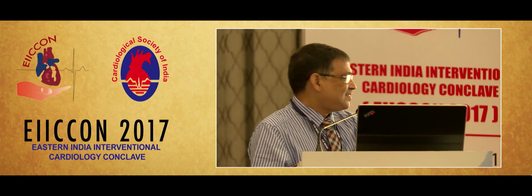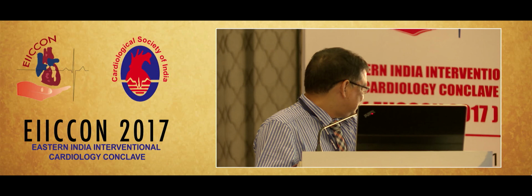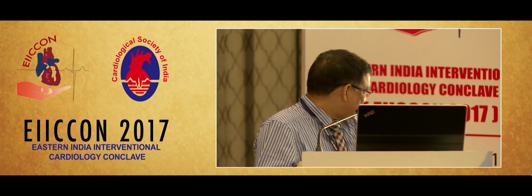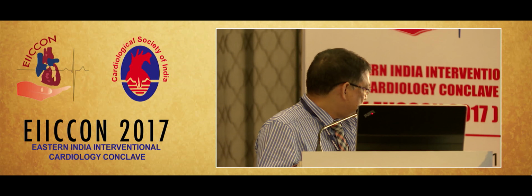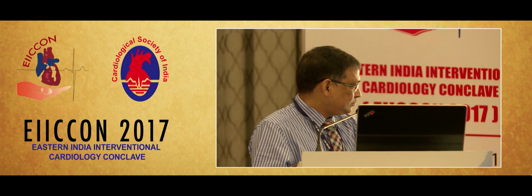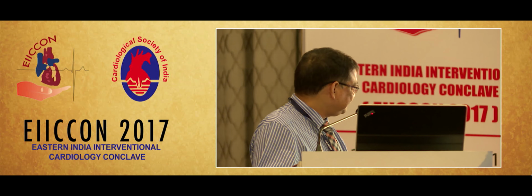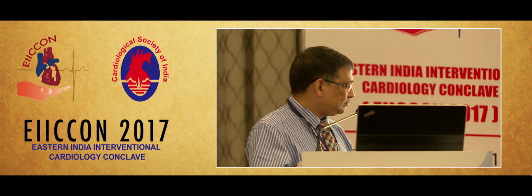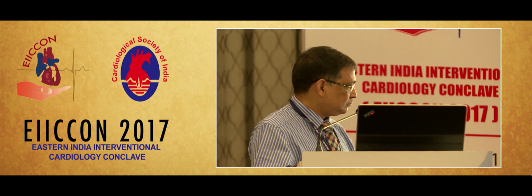And actually in the DK crush, the restenosis rate and MACE was as low as 5% in the left main bifurcation. And now EBC is taking the Onyx stent, they're putting Onyx in the left main, and they're taking 450 cases. It's an ongoing project with the leadership of Chiaffo from Italy. They are seeing what is the best stent strategy, single stent strategy or double stent strategy, in this EBC trial with 450 patients with left main stenting, and they are putting Onyx in all the patients.